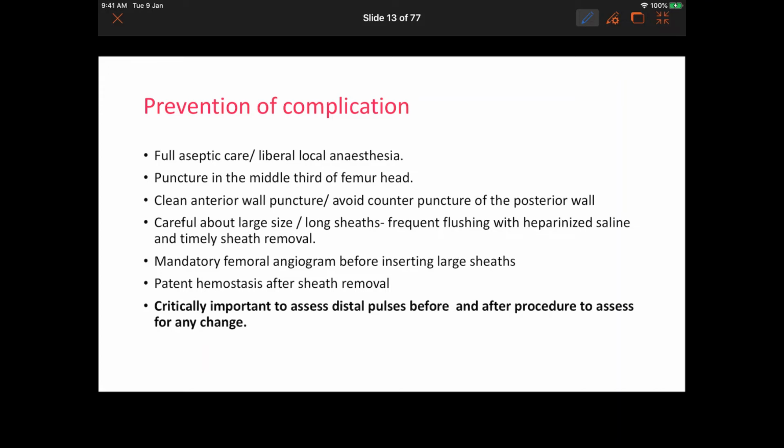So this is very important, and also puncturing the anterior wall is very important. So while puncturing, it's important that you are very steady, slow, and try to get this tactile feel. And believe me, with some practice and care, you can really feel the hollowness that happens when you puncture an artery or a vein. You can feel that you have punctured, you have entered the lumen.